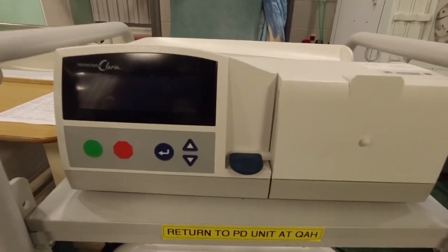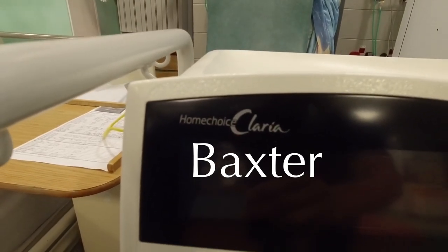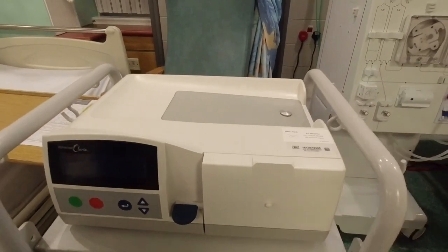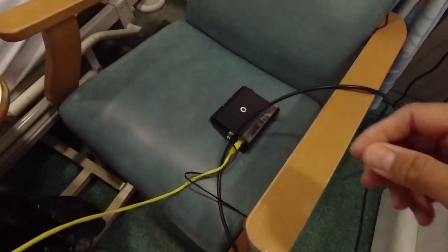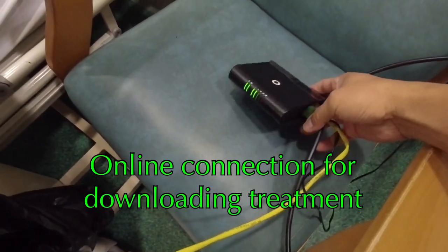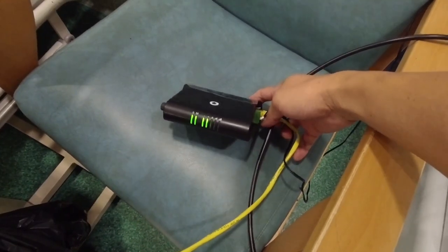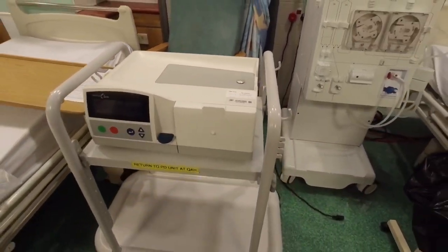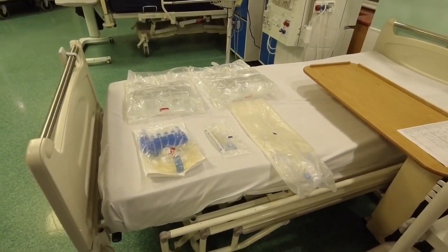So that's the machine we'll use, the HomeChoice Claria, for our APD. It also has a connection for the internet, so the treatment goes straight to the computer. There you go. So that's all we need, the APD machine and our supplies.